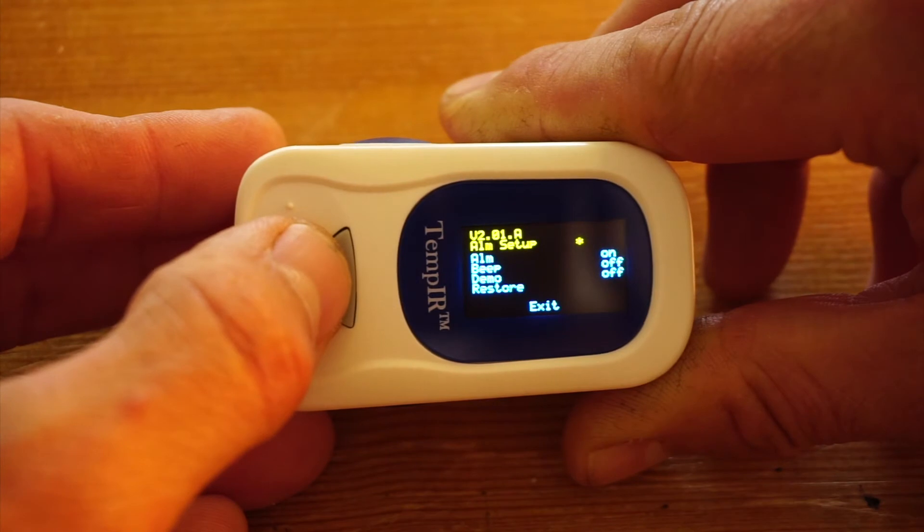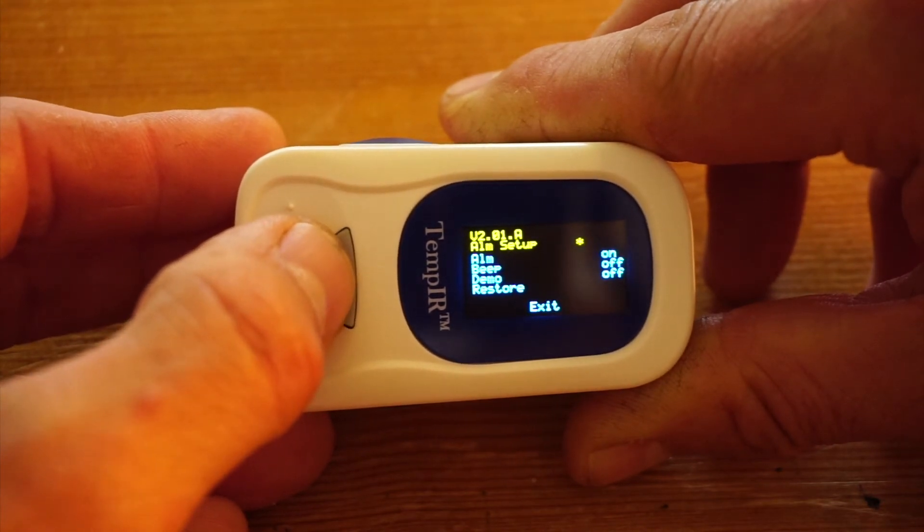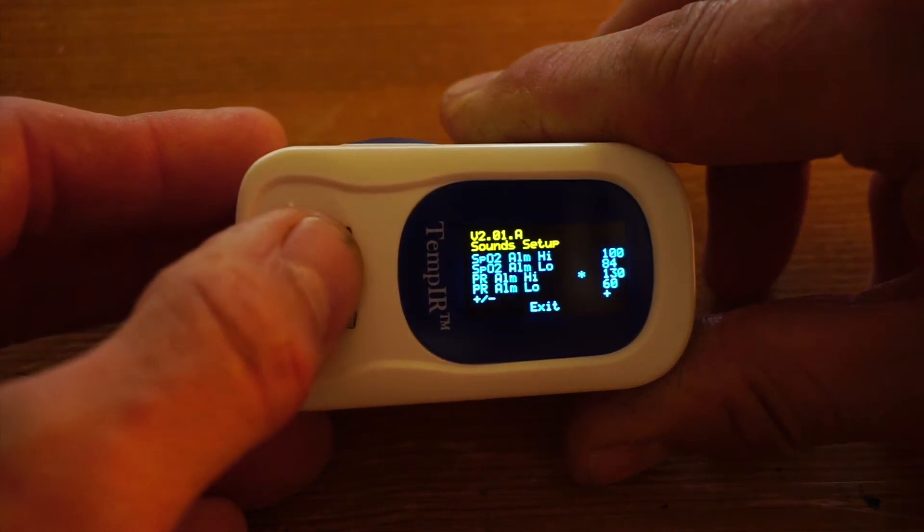This is the sound setup menu where you can toggle the alarm, the beep, and the demo on or off, or you can restore back to factory settings. And now I'm back into the alarm setup.